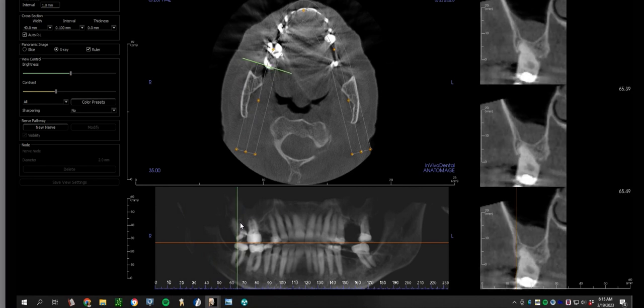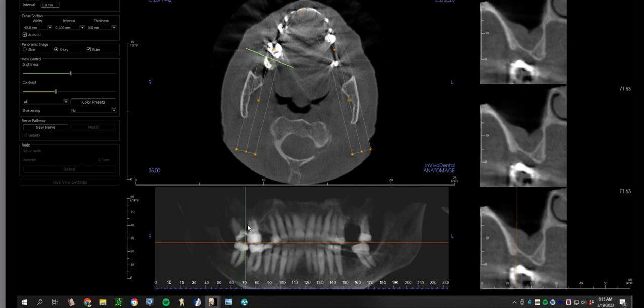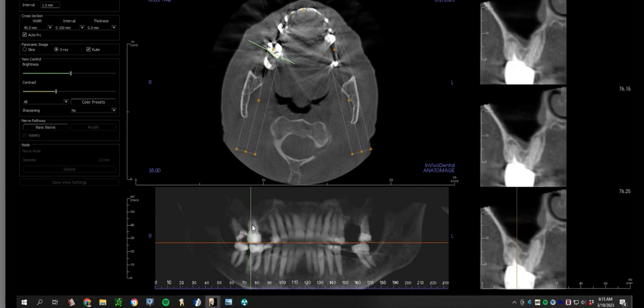But I'm coming across here, now I'm starting to come across number 3. Number 3 has endo treatment. As we can see, root canal here on the distal buccal canal. Again, thickening of the sinus. Now this guy up here might be a polyp. It's not associated with the teeth, but one can imagine that these things exist in people all the time and we just never see them.